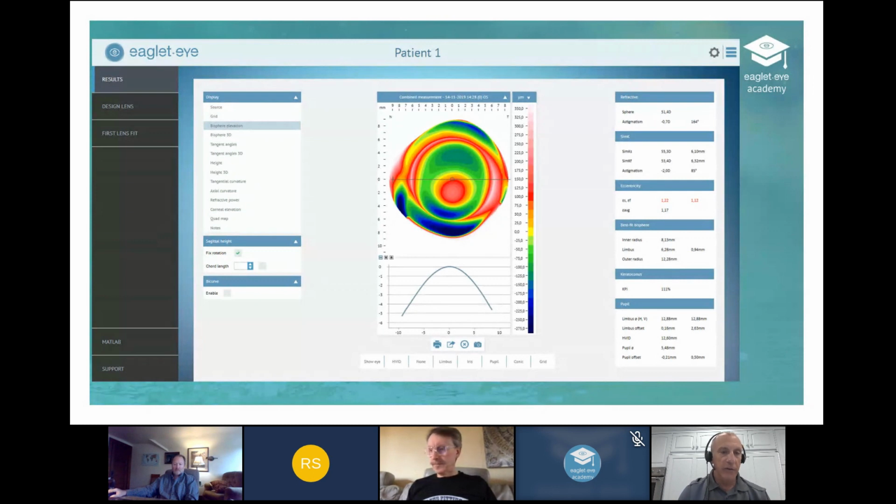What we did is the Eaglet scan, and what's amazing, this is how it works day in and day out, is that the Eaglet predicted a sag of 4950 on the right eye. The ultimate lens was a 4900. What helps a lot is when I go to put on that diagnostic lens, right now we still are going to put on a diagnostic lens to calculate the power, and that's really what we use it for.